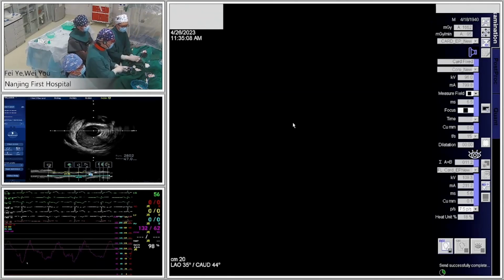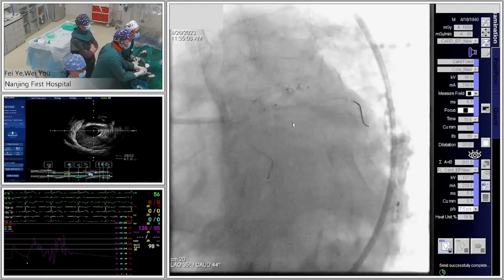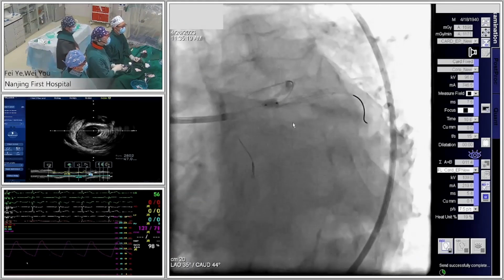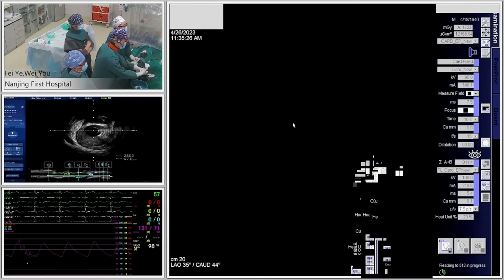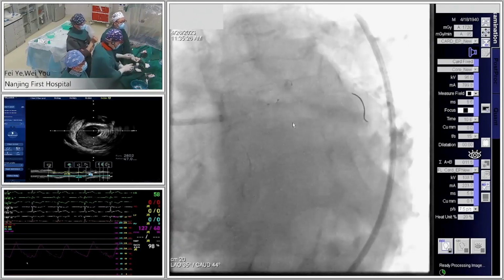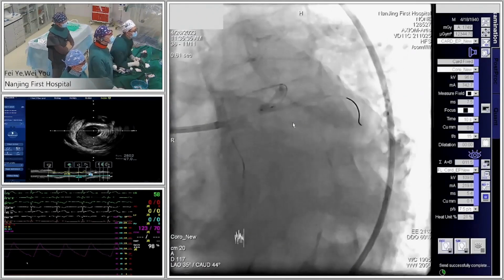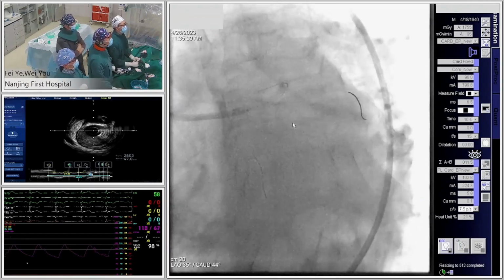Okay, so test, please. Make sure, okay. Yes, good. Inflate. Just 10. At the proximal part of the bifurcation, 12, 14. Yes, we can see from the angle the balloon has a very short shoulder. One more gain. 10. Yes, enough. Done. This is a full POT balloon with a very short shoulder and short length.